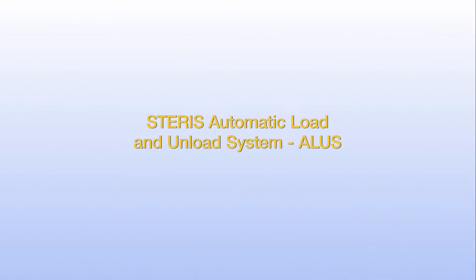The following program shows how to properly operate your automatic load and unload system, also referred to as ALUS. This program is presented in six sections.